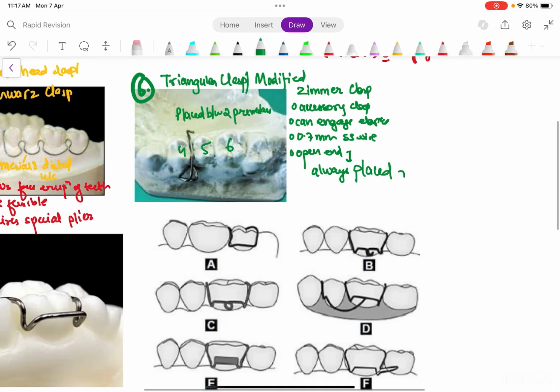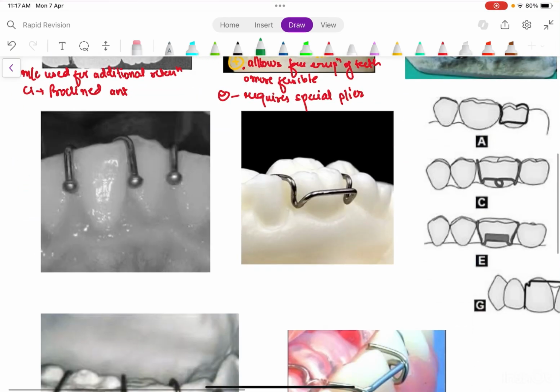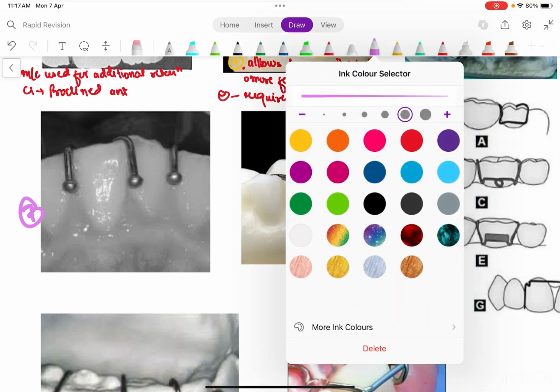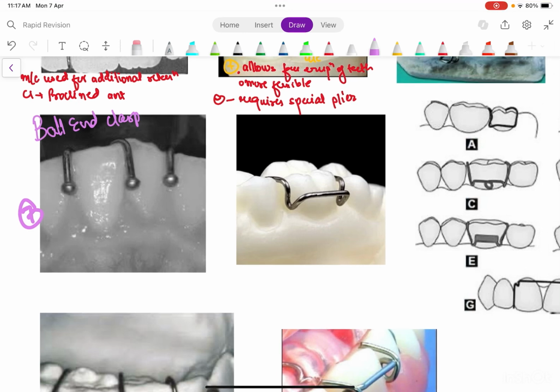Now let's talk about seventh. So 7th, this is the ball end clasp. Now it is similar to the action of the triangular clasp. Disadvantage: it cannot be used if the adjacent tooth is absent.